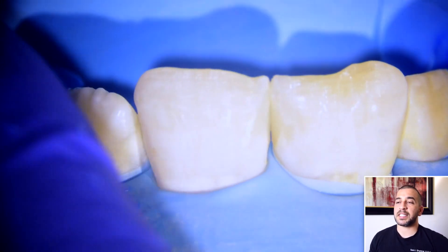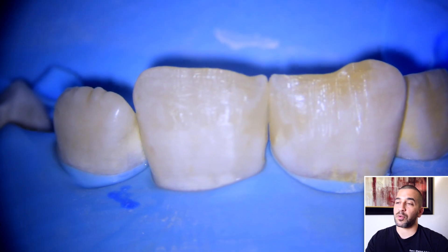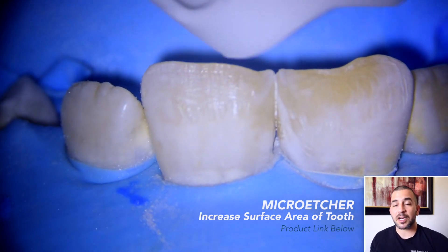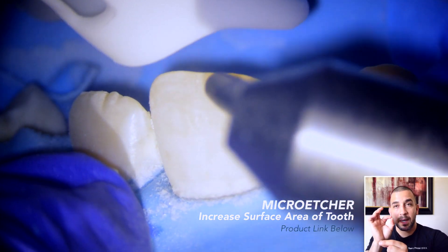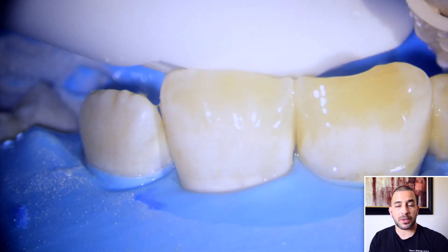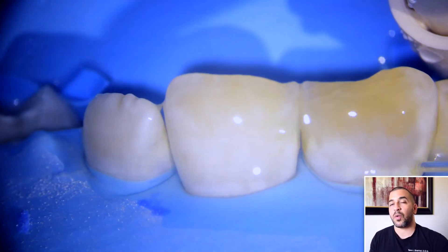This close-up gives you an idea of how conservative the preparation is. You can see some of those vertical strokes on the tooth as well as how the surface is a little bit more rough. Now that's all I'm going to do with my dental drill, but I do like to use a micro etcher which allows me to do something called air abrasion therapy. Basically it shoots aluminum oxide — these small particles — on the tooth surface. It's a powdery-like material and very conservative; it doesn't damage the tooth. It's merely another way to roughen the tooth surface to allow us to have a more successful outcome when we do our bonding protocol.